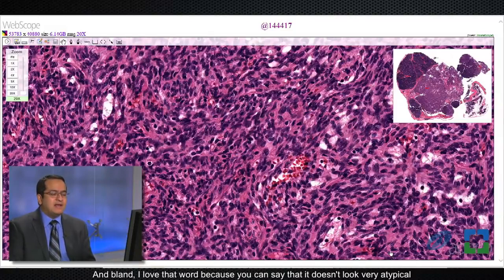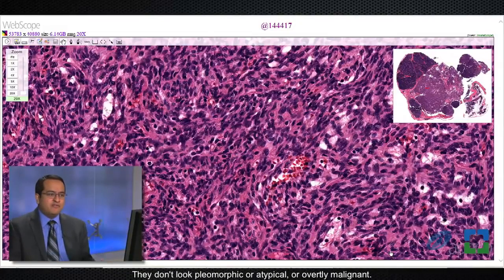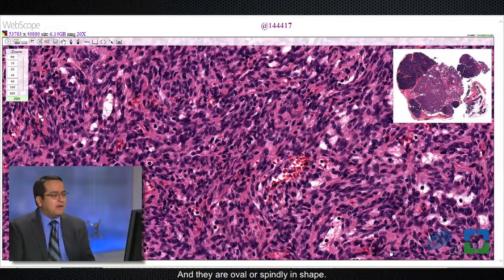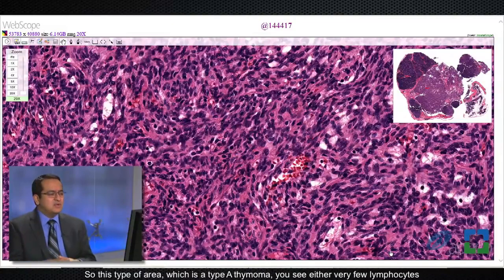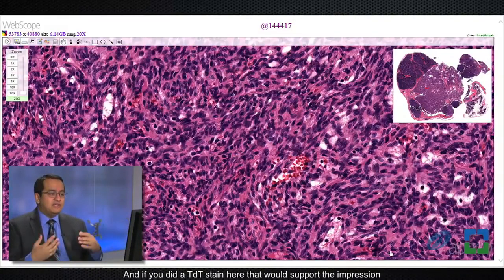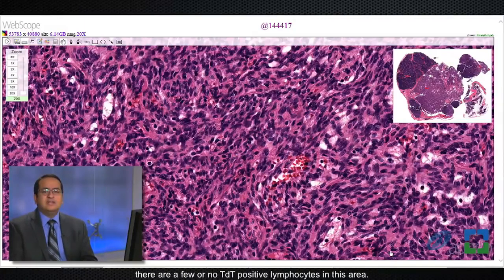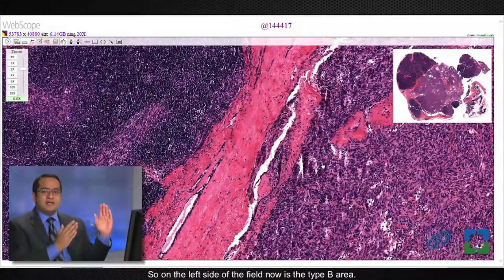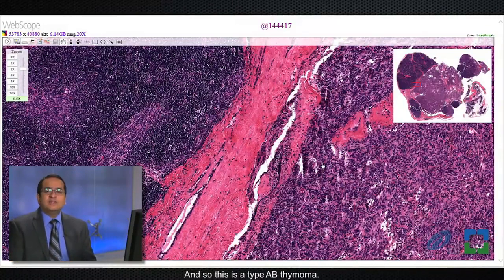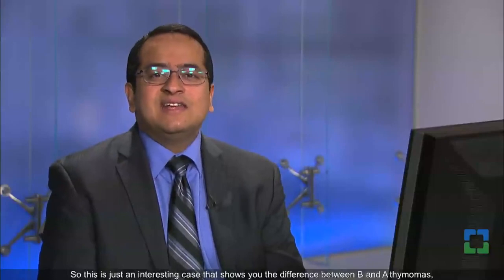These cells are very bland — cytologically bland. I love that word because you can say it doesn't look very atypical without saying that it's benign. These cells don't look pleomorphic or atypical or overtly malignant; they are oval or spindly in shape. The one very big difference from the other area is that lymphocytes are very sparse here. In this type A thymoma area, you see either very few or no lymphocytes, and a TDT stain would support that impression. At low magnification you can see the junction between the two areas — the type B area is on the left side of the field and the type A area is on the right, making this a type AB thymoma. This is an interesting case that shows the difference between B and A thymomas, the mix that defines type AB thymoma, and the difference between a thymoma and normal thymic tissue.